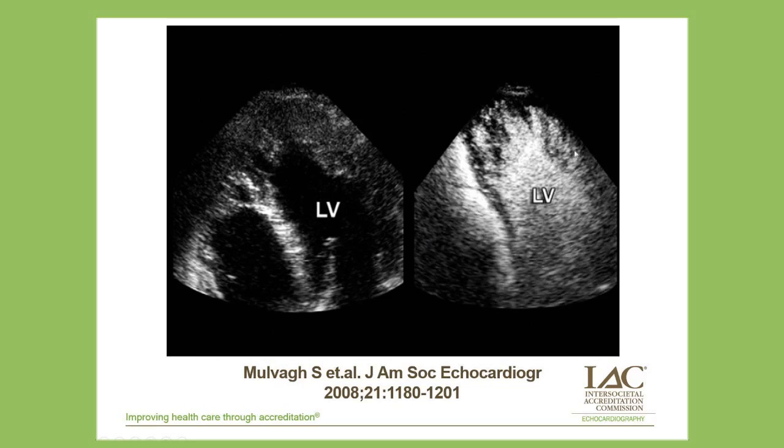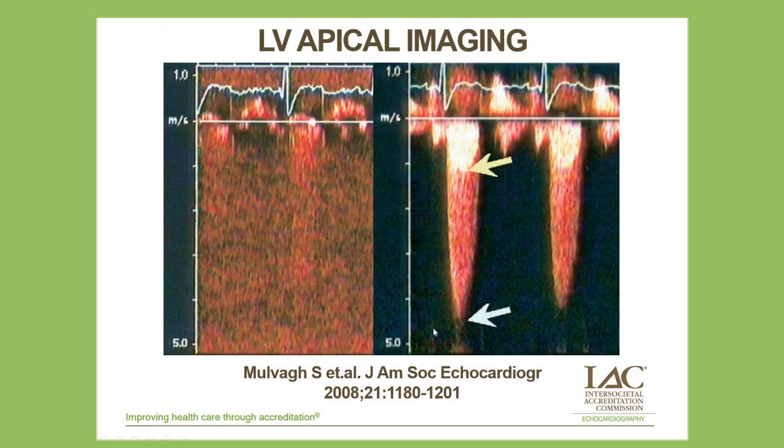And in the setting of isolated non-compaction, you can again see that because low mechanical index imaging doesn't produce any myocardial contrast, it delineates very nicely the deep recesses of contrast-enhanced regions in that non-compacted layer and the little trabeculations of muscle and their extent when trying to make this diagnosis, and is clearly beneficial in defining that non-compaction to compaction ratio that's required for the diagnosis. It really requires contrast here in order to be able to delineate that when compared to a non-contrast study.